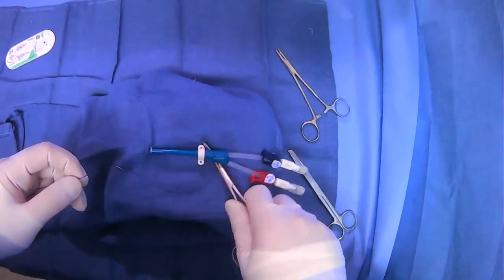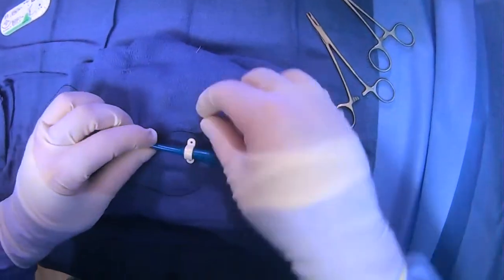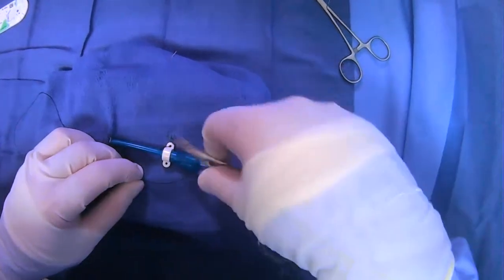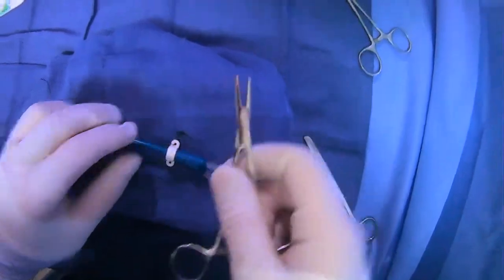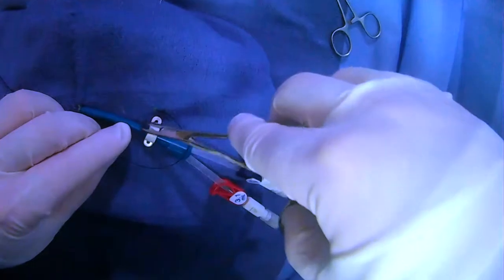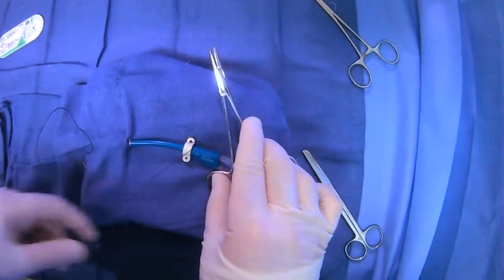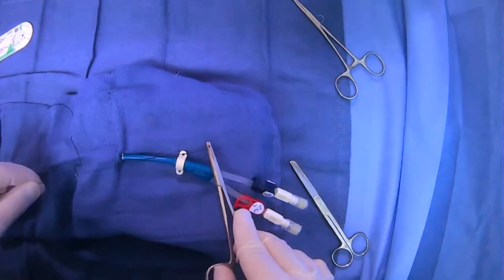Then you can just disengage your clamp and pull the string through like so. It might get a little tricky here, but we'll just grab the tip of our suture. And now we can instrument tie as well.